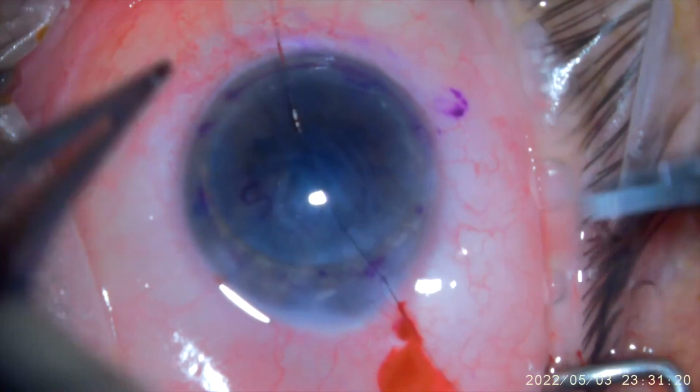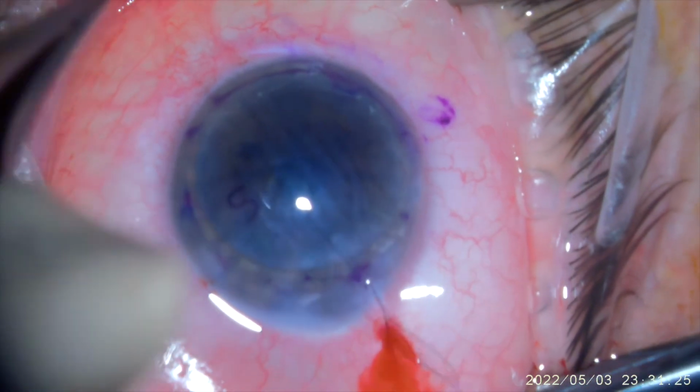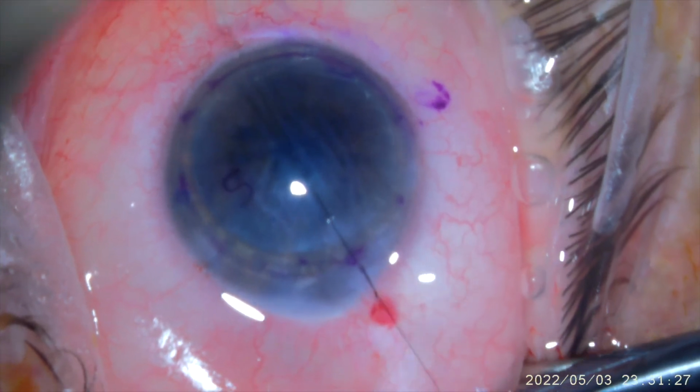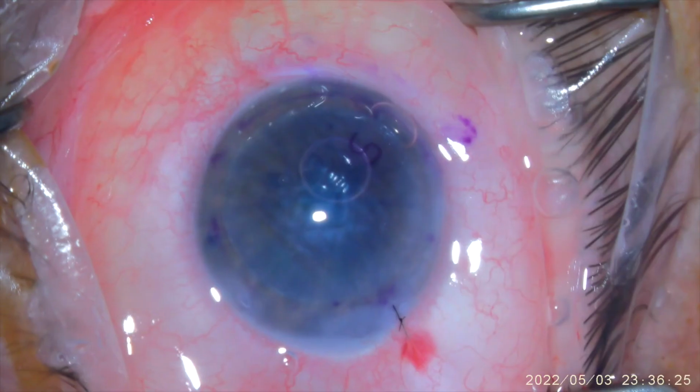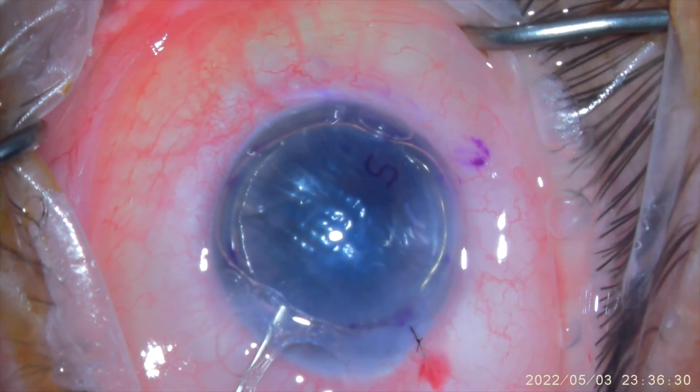Next, I put a suture through the main incision, just a 10-0 nylon. I do a slip knot. I don't tighten it all the way just yet, just to keep that sealed so when I put the air in subsequent steps, it will not leak out of this incision.